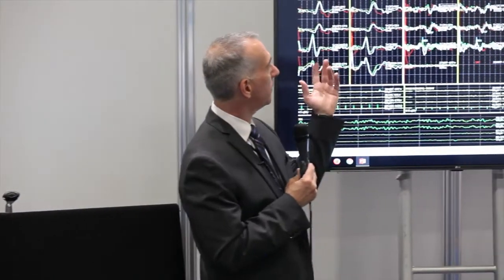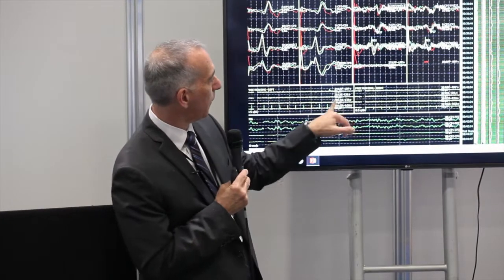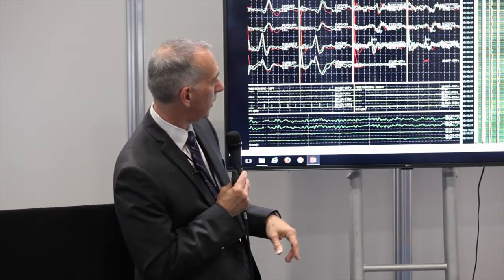This is a typical display of what we'll see on average cases where there are somatosensory evoked potentials and free-running electromyography from various muscles bilaterally, and a little bit of EEG to basically help us a little bit with depth of anesthesia and that type of thing. So we look for any change in our data, especially with SSEPs. We look for a 50% drop in amplitude or a 10% increase in latency. Anything suspicious if the morphology is changing.